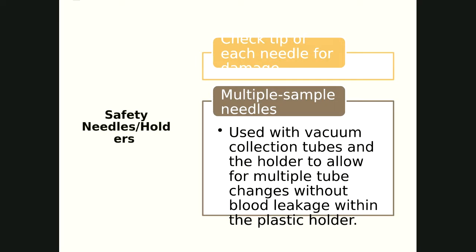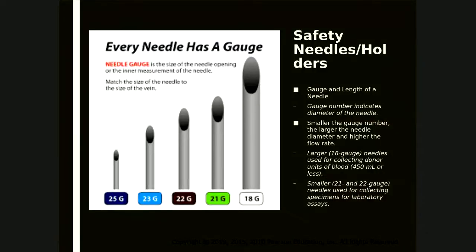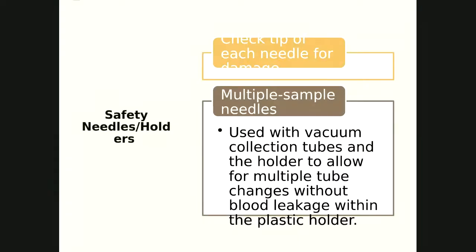We're going to check the tip of each needle for damage. Multi-sample needles are used with vacuum collection tubes in the holder to allow for multi-tube changes without blood leakage within the plastic holder. So the bevel that we will be checking, I'm going to go back to this slide here, is this hollow portion of the needle. We want to make sure that it isn't damaged prior to sticking our patient. Multi-sample needle means we could draw 2 tubes, we could draw 20 tubes, but it prevents leakage. So we can use one needle for all the test tubes we need for our patient.